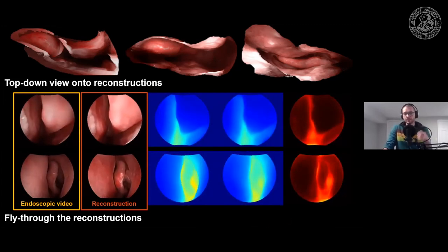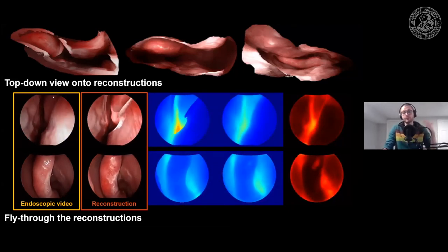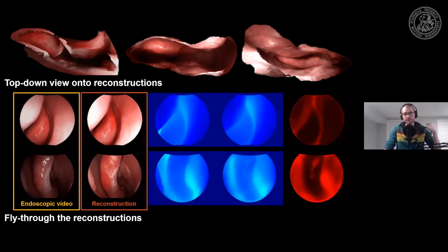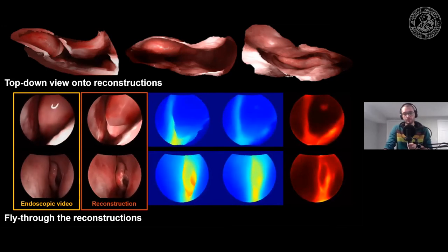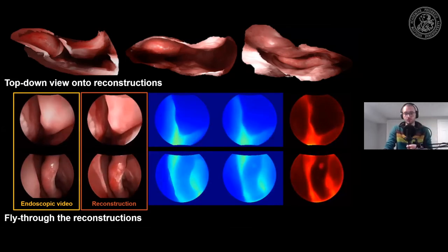So qualitatively, these look very good. And when used for 3D registration to a CT scan of the same person, we observe submillimeter residual errors. So this seems to be in very good agreement with the anatomy that you would observe in a CT scan.